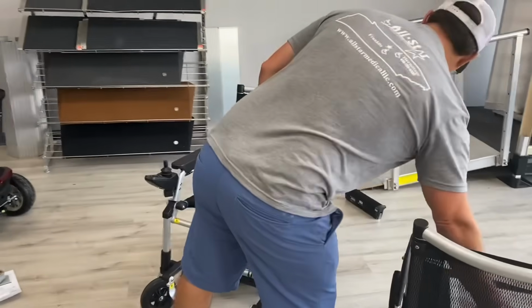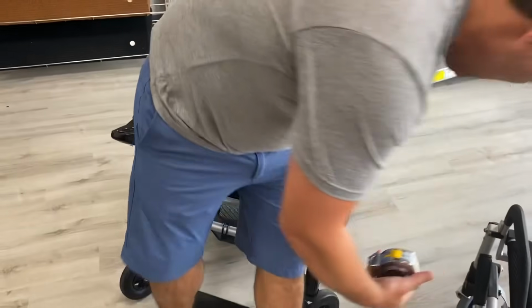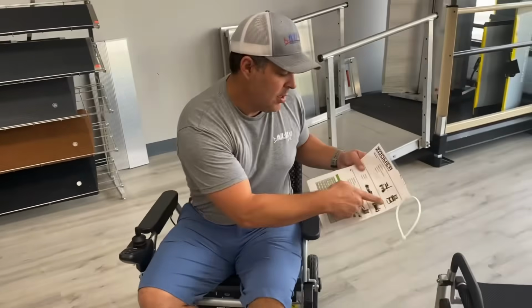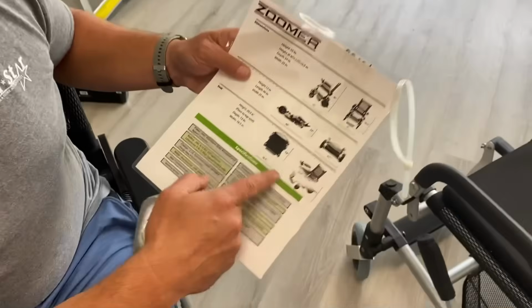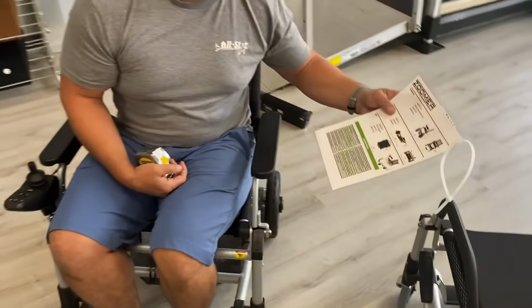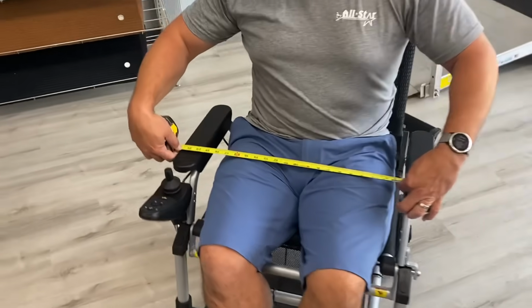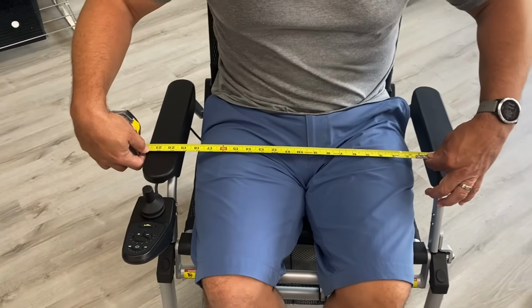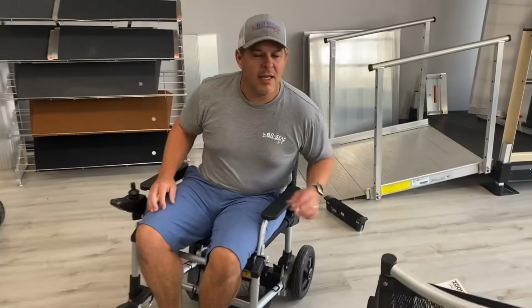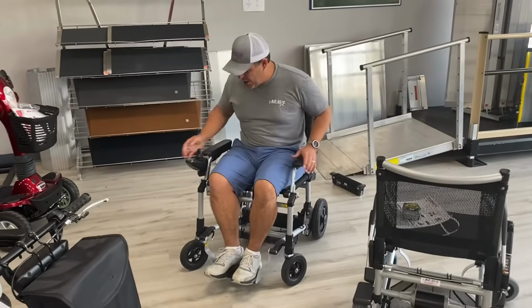One of the things I wanted to also show was on this version here, it says that the seat width dimensions are 16 by 13. But that's the actual padded seat portion there. It's actually between the arms, it's 19.5. So you've got plenty of room in here. I'm around 210 and 5'8". So I've got plenty of room to sit in here and sit in this chair.